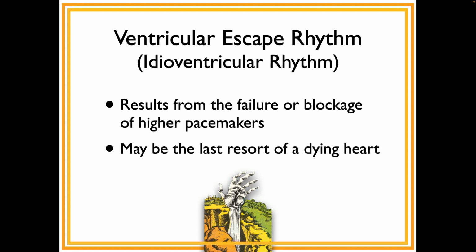Okay. Moving along, our next rhythm is called ventricular escape, or idioventricular rhythm, and for reasons I don't know, it's not as commonly just called ventricular rhythm. So pick one, either ventricular escape rhythm or idioventricular rhythm. And even though I said idiojunctional is old-fashioned, people still use idioventricular, so I don't know why. Just the way it is. You'll still hear a lot of people say idioventricular.